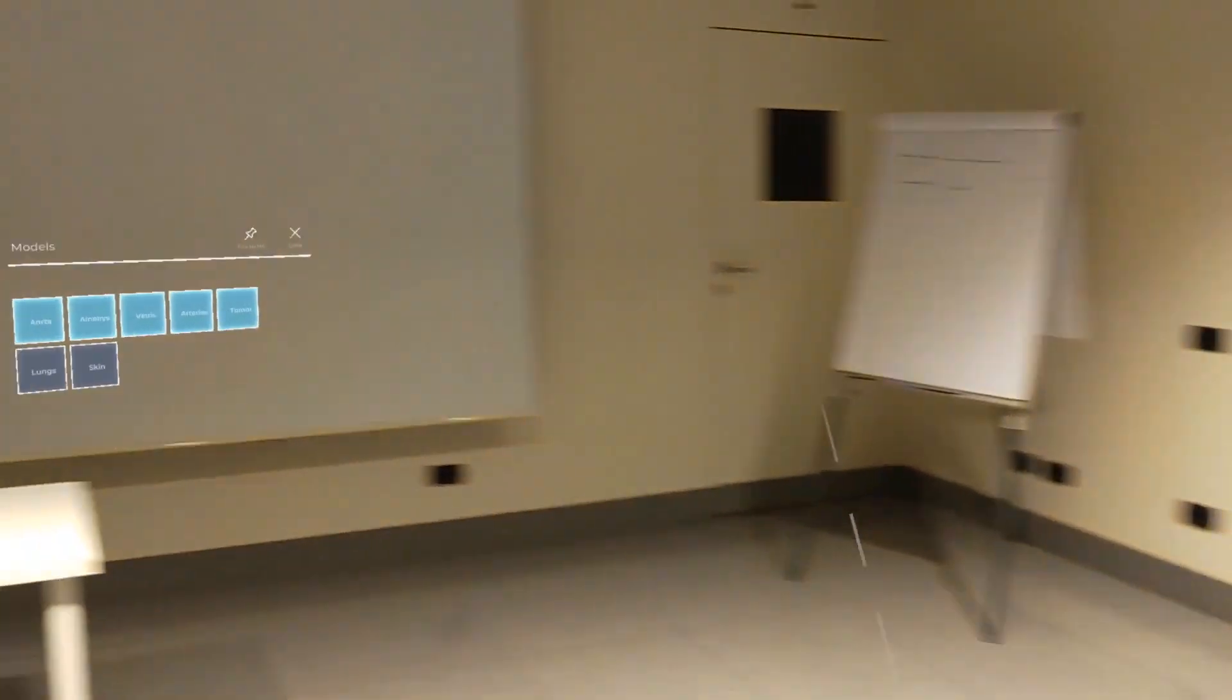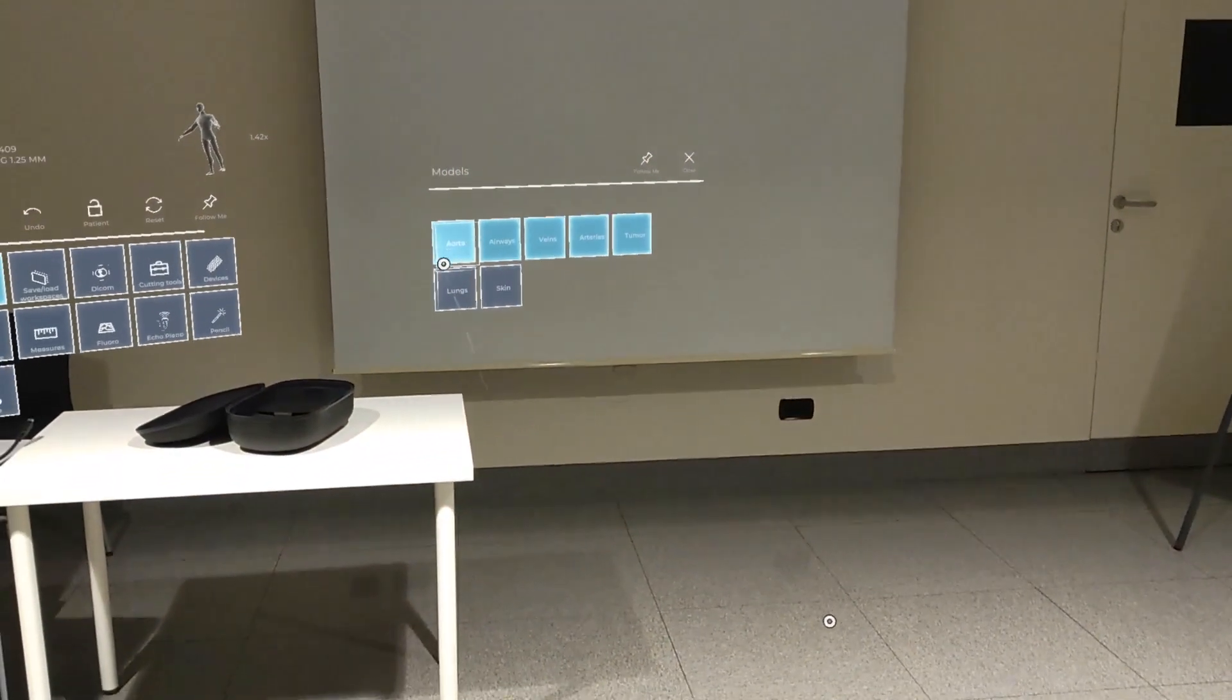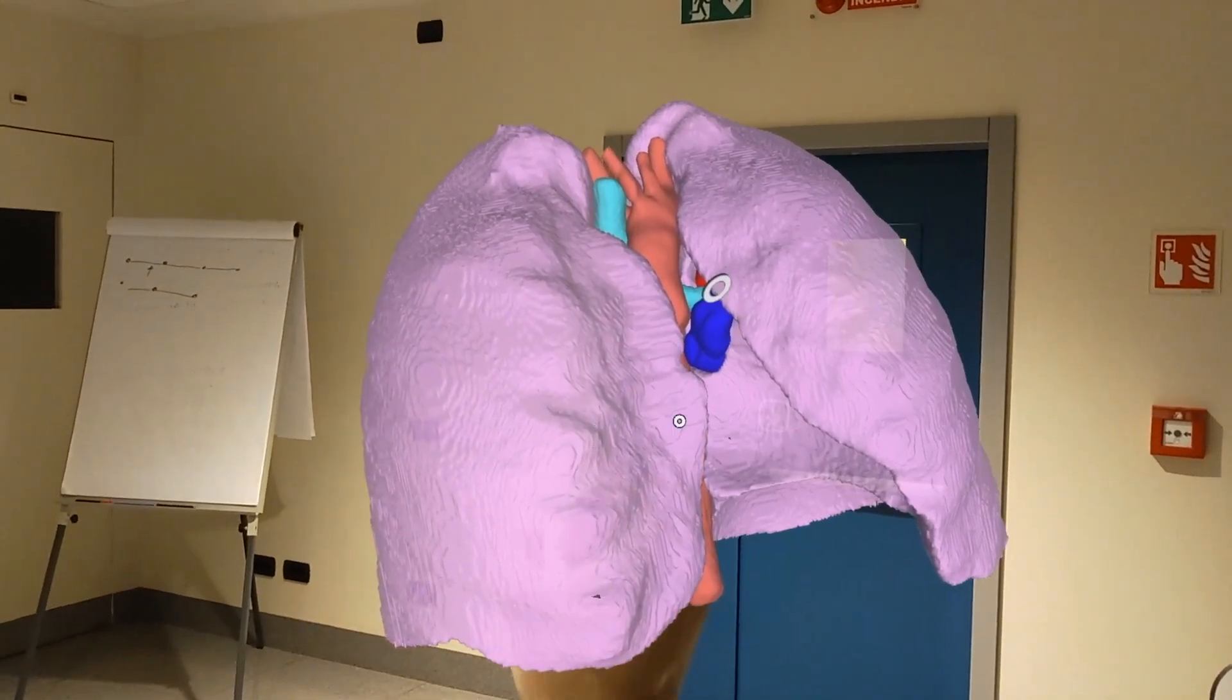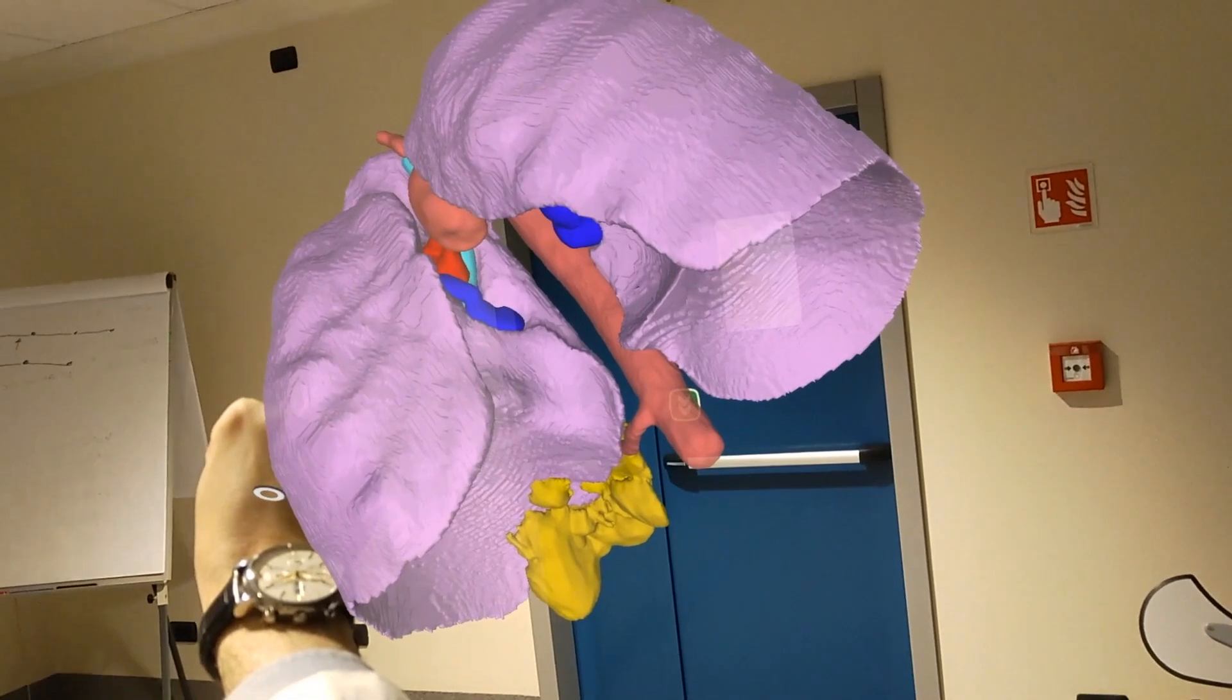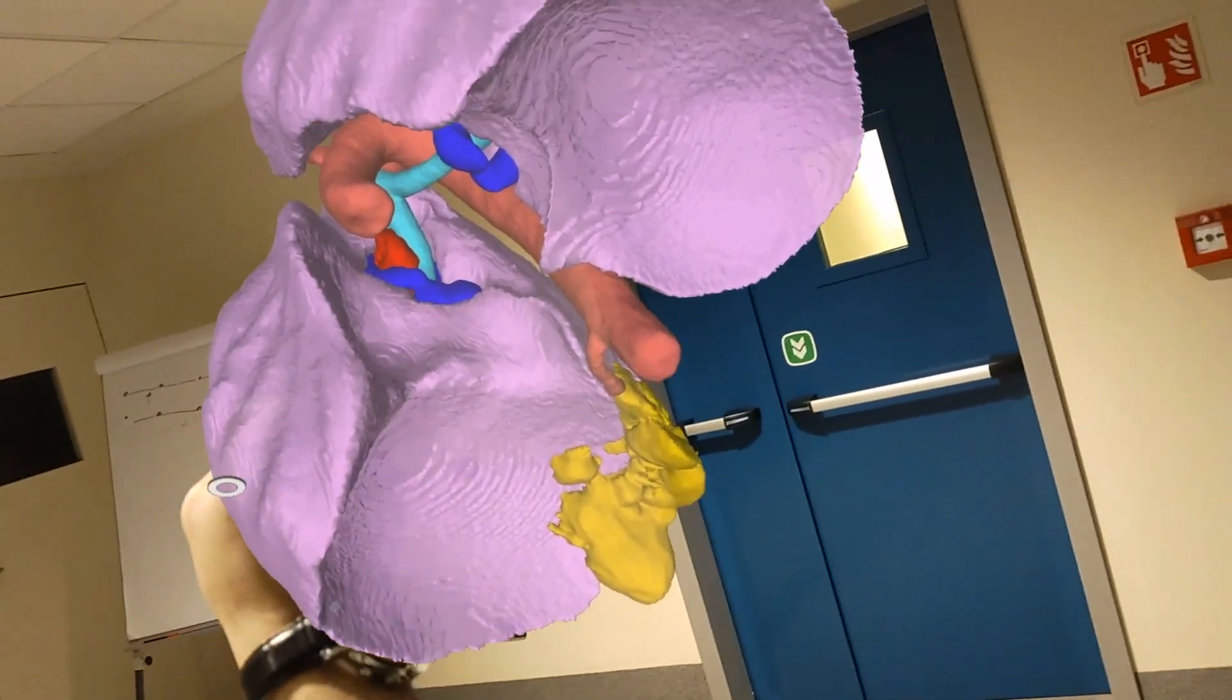We then introduce the pulmonary inflated parenchyma to clearly visualize the sequestration within the lobe, and thanks to complete rotation of the model, we can have a dedicated view from the basis of the lung.